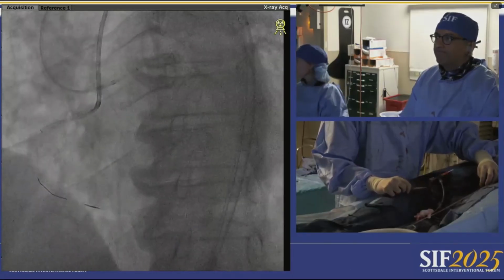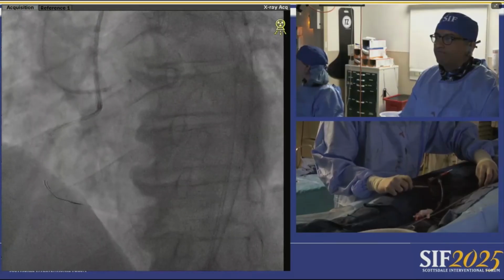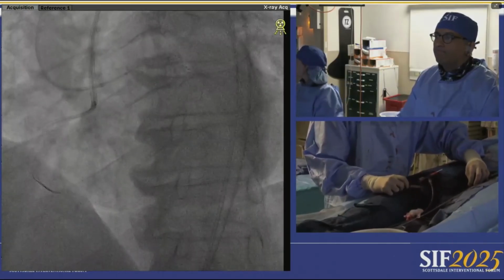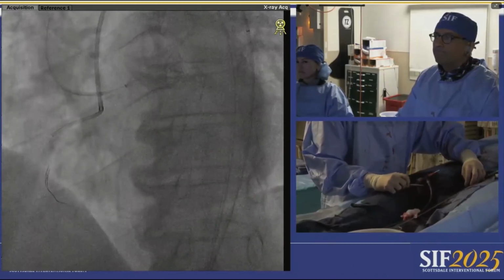So that's a big discussion. If it crosses very smoothly, like Ashish has made it look effortless here, then you're in a great spot to solve this case very definitively.